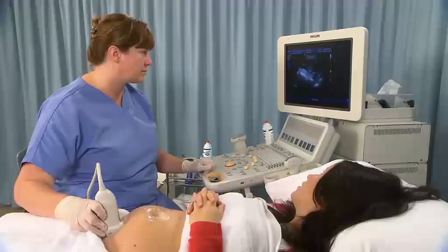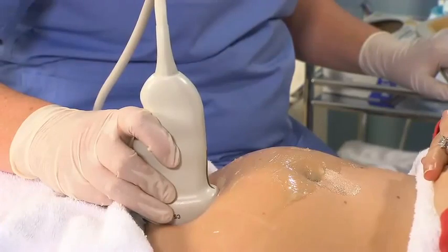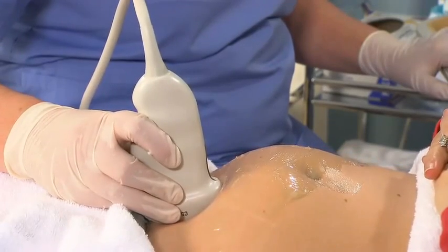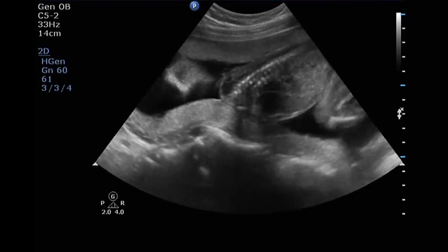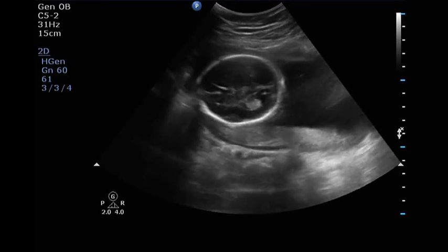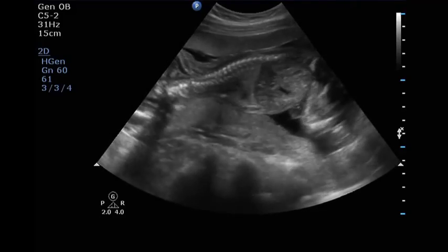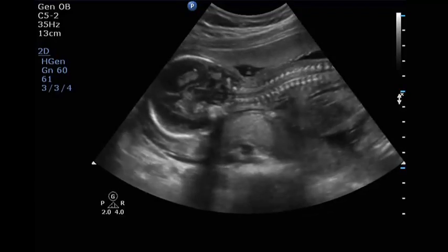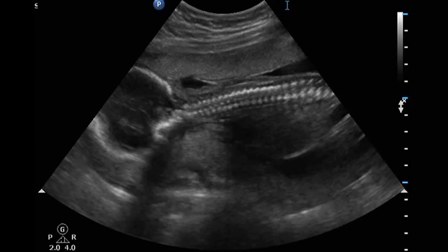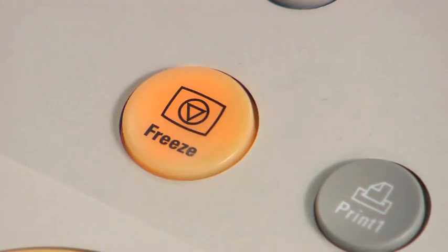To determine fetal lie and presentation, place the transducer in the longitudinal plane with the lower edge just superior to the symphysis pubis. Manipulate the transducer until a suitable image of the uterus is obtained. Slide the transducer to the mother's left and right to view the fetal head, then slide and rock until the fetal spine is identified. Rotate the transducer until the fetal head and body are on the same image, then freeze, annotate the scan plane and fetal lie and position, and save the image before continuing.